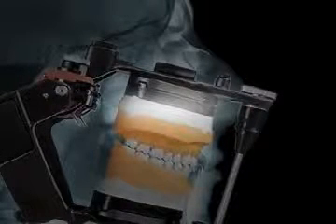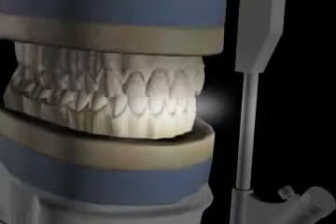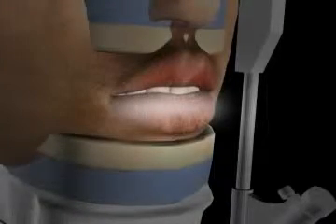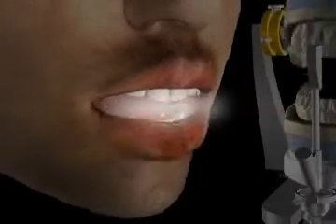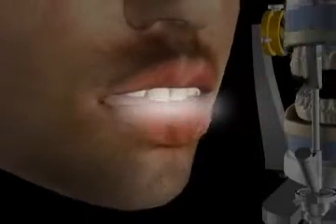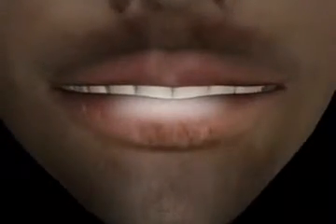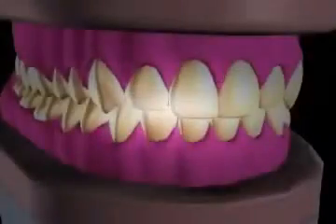Furthermore, it is now recognized that the jaw joints are very susceptible to changes, and the traditional, strictly machine-oriented view of the jaw joints has increasingly been abandoned. In the past, patients were forced toward an ideal bite that was set by the articulator. This had the unfortunate result that many individuals developed facial pain. Nowadays, the treatment of jaw joints and the associated bite is much more restrained. Only pain is treated, not the discrepancy between the bite and articulator function.